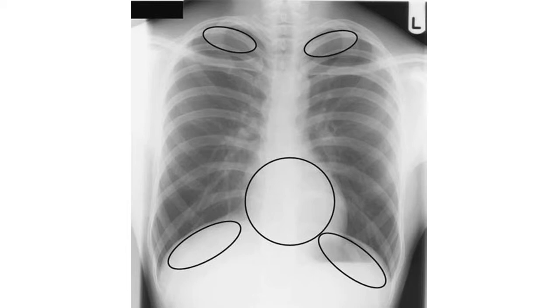Behind the heart there may be some lesions in the lungs, but we cannot see those areas in this image — this is another hidden area. Lung tissues are definitely present under the hemidiaphragms as well, so we also have to look for lung lesions under the hemidiaphragms in chest X-ray views.